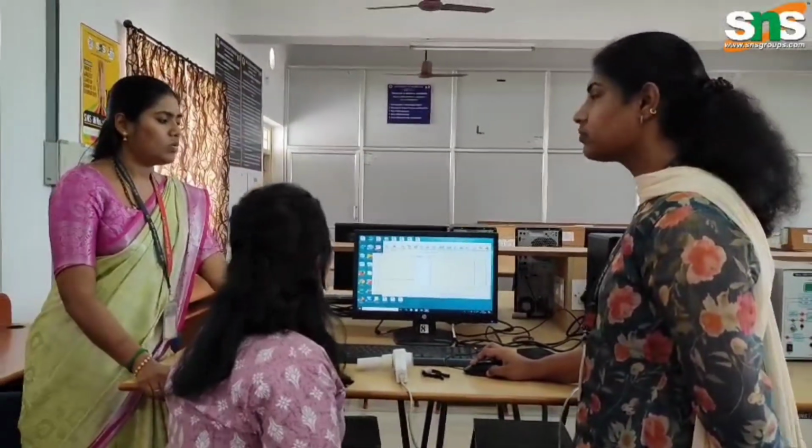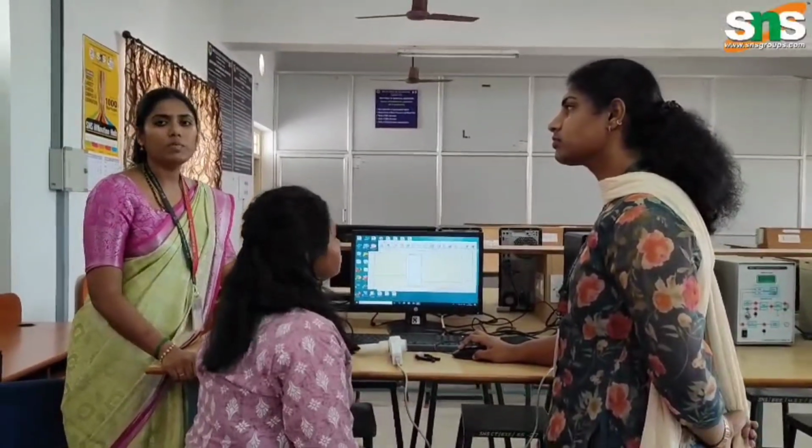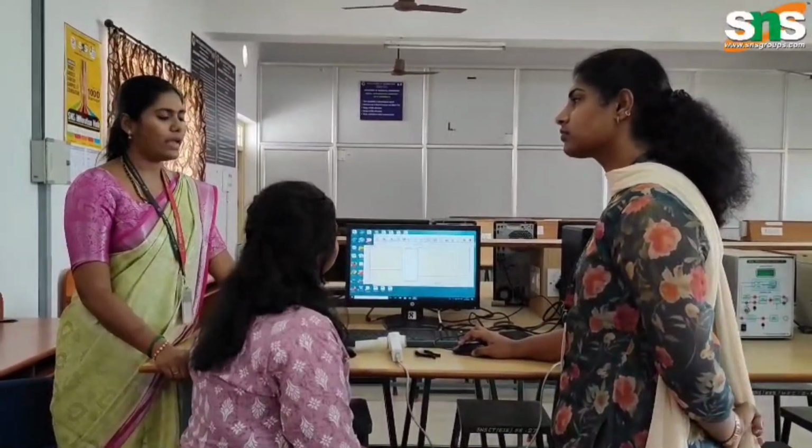So I think you might have understood this spirometer experiment to some extent. Hope you like this video. Thank you.